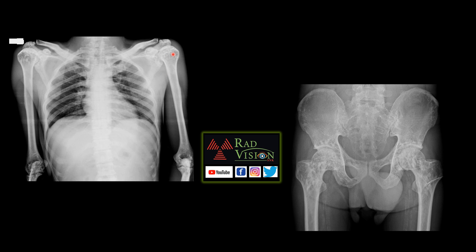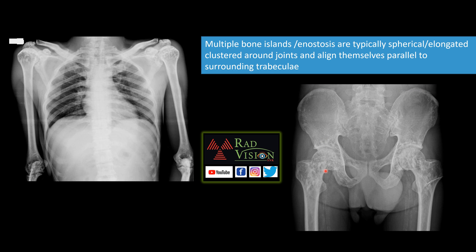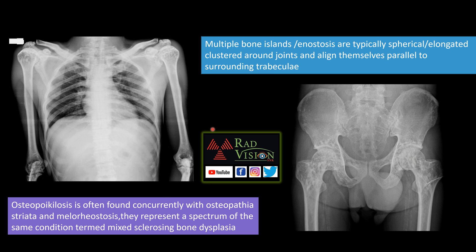The next case shows multiple round to oval spherical areas of sclerosis in a periarticular distribution, symmetrically clustered around the long bones adjacent to joints. These are multiple bony islands or enostoses. They can be spherical or ovoid, clustered near joints, and are aligned parallel to the trabeculae. This is a case of osteopoikilosis.